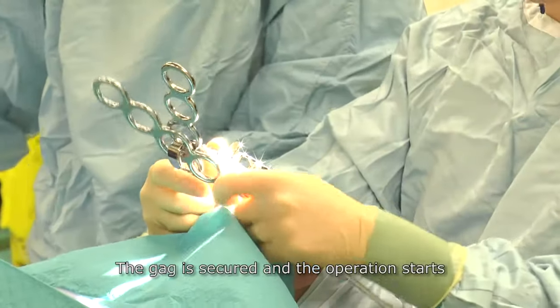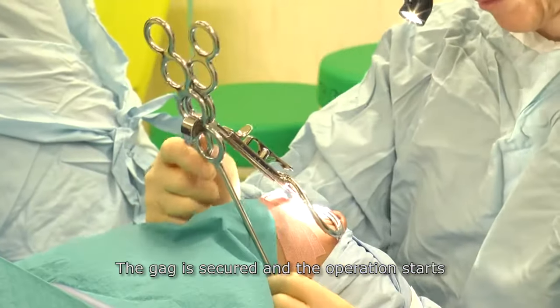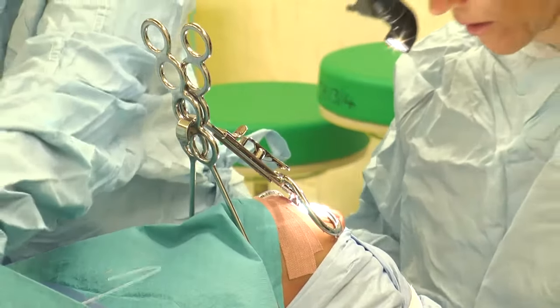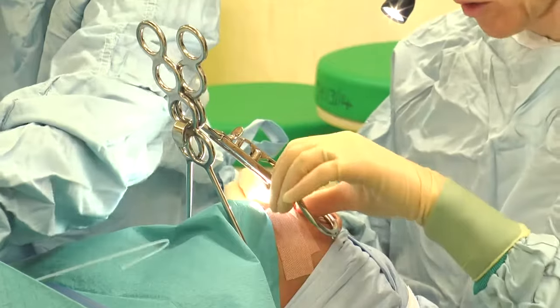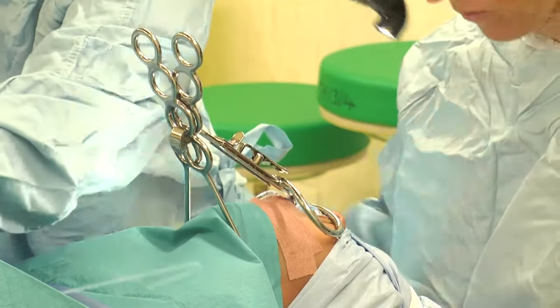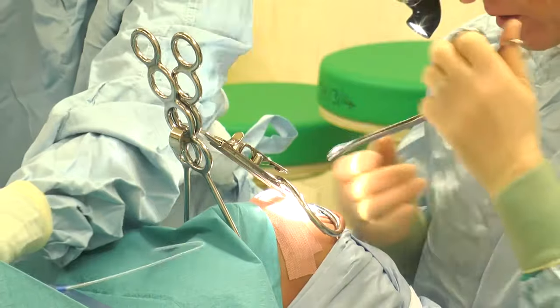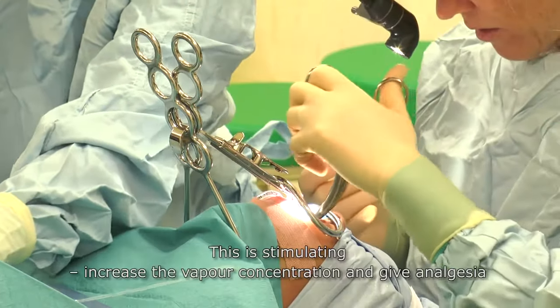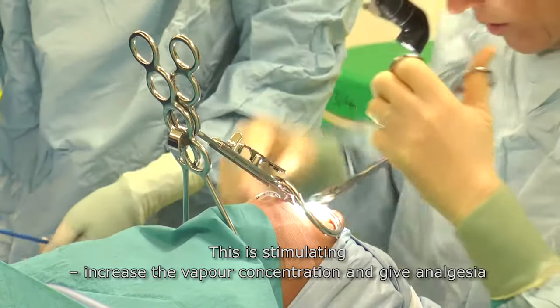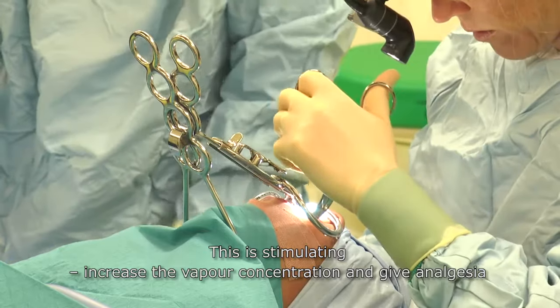The gag is secured and the operation starts. This is stimulating. Increase the vapour concentration and give analgesia.